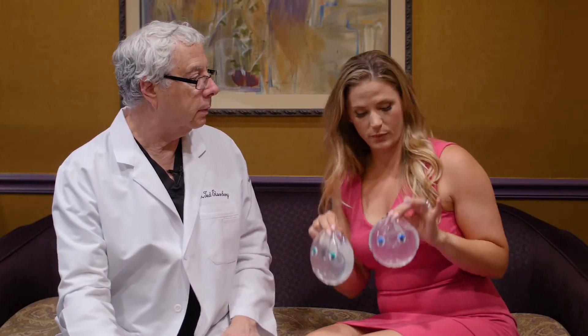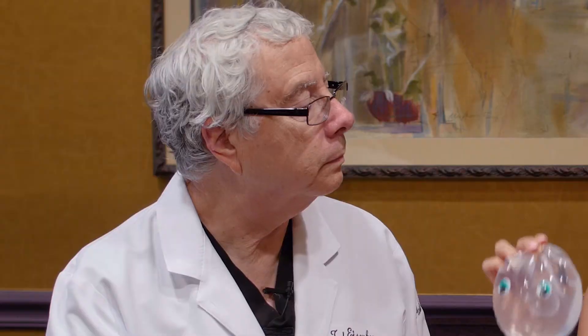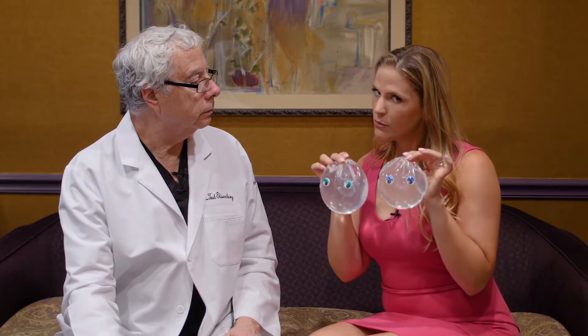We're going to talk about cleavage a little bit, and I've got my two little friends here. These are saline implants. If someone's concerned about cleavage, that's something that they want. Can adding breast implants like these actually create cleavage?